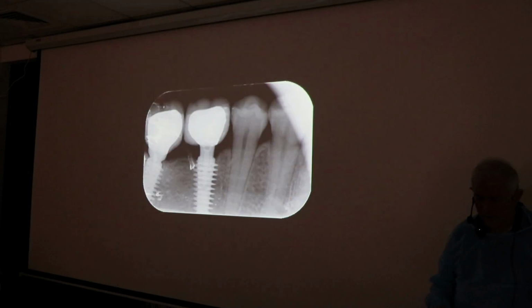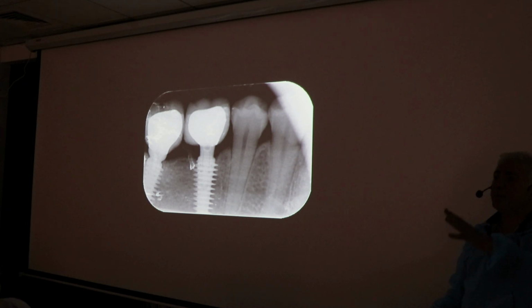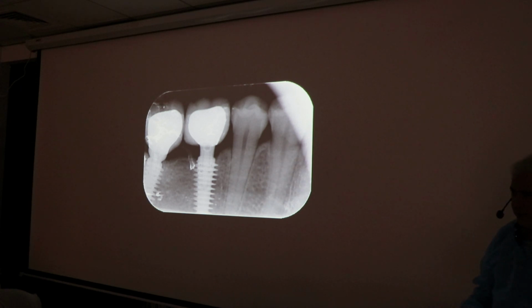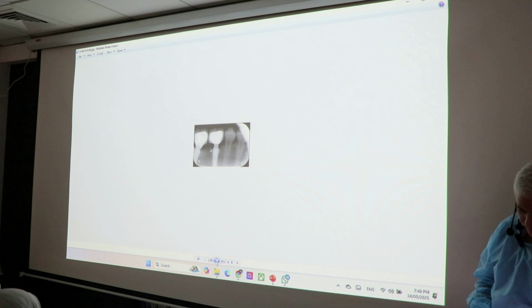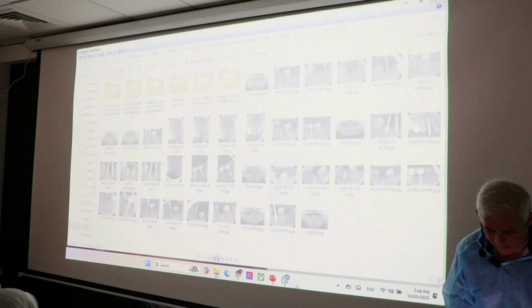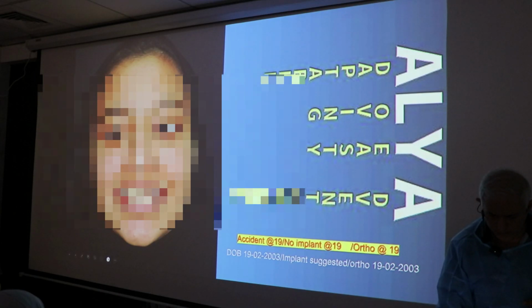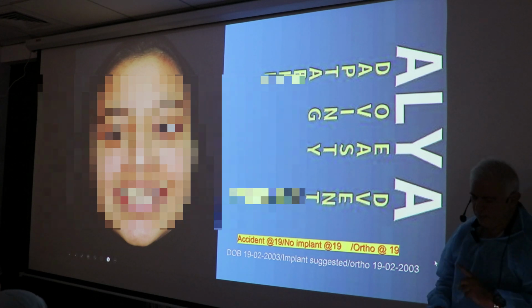Anyway, going back to something Sundar said, which was very Sundar, in Hindi it means beautiful. He said there are no fixed rules, that it's 100%. According to Einstein, it's all relative. So in this case, we could place an anchor behind the molar, we could get 2 millimeters, we managed. In some cases, we can't, and we just have to manage the existing scenario with what we have. This is something Sundar touched upon, and I just wanted to prove him right.